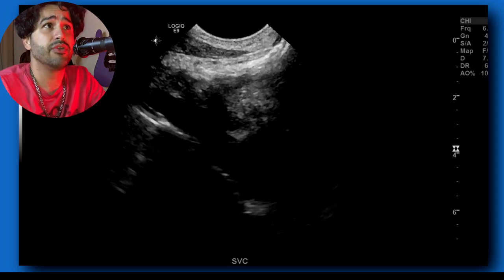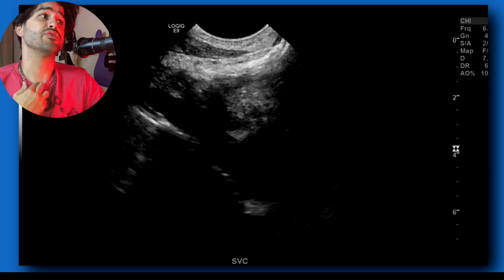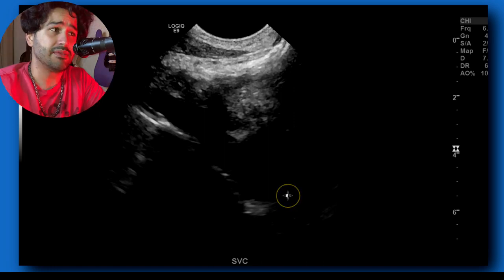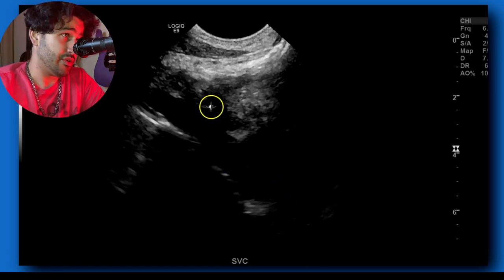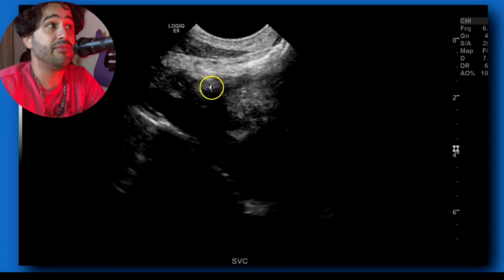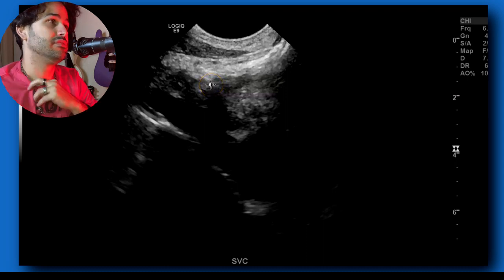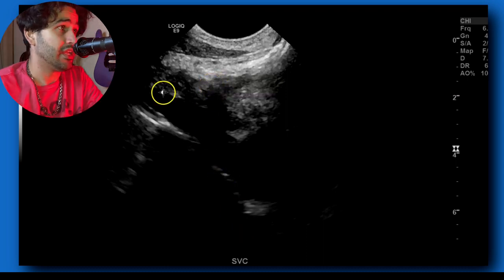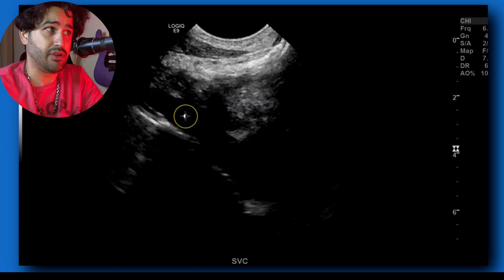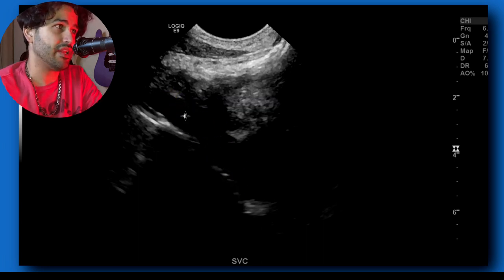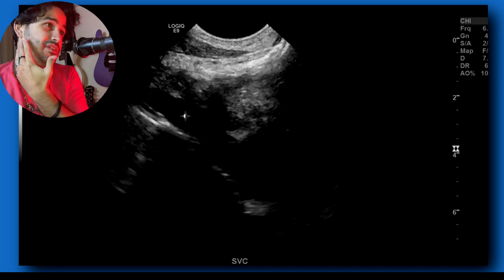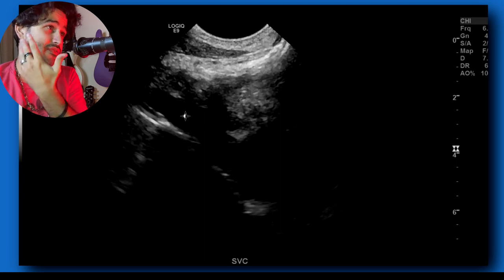In this patient I began with the microconvex probe that goes up to 10 MHz, lowered to 6 MHz. Suprasternal notch, angled down towards the heart. You're already getting some clavicle shadowing here. And then this is the right brachiocephalic vein — they also call it the right innominate vein. I like brachiocephalic better because the vein literally gets drainage from the arm and the head.